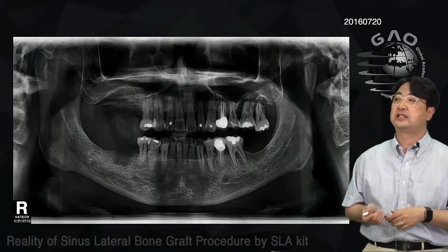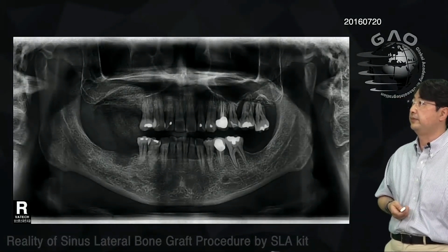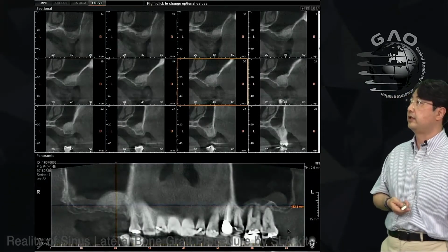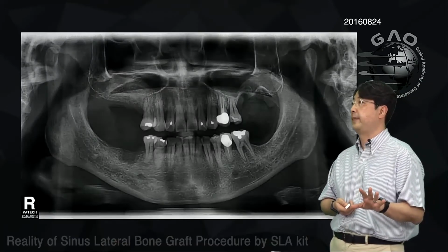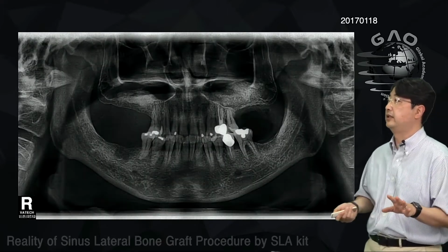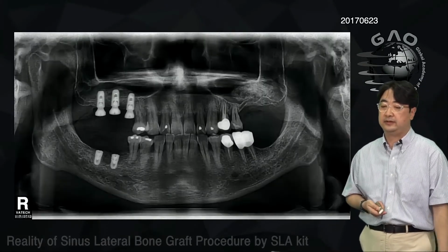Okay, so this is a revisit of the maxillary sinus graft case, right? Here you can see the bone graft on the right side. And here is the CT scan after the sinus graft, after the second sinus graft, right? Then this is how it looked afterwards, and I waited, and I did the lateral approach for this left side as well. Okay, then we placed the implant like this.